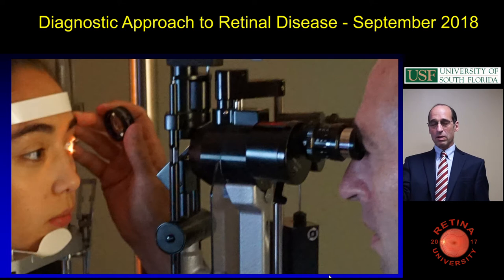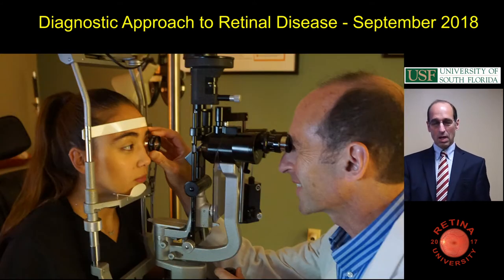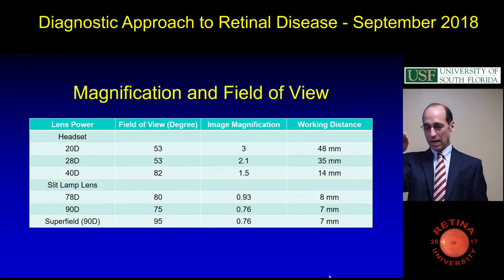So what I do is I have a whole routine. I put the slit lamp in, I line the light up with the eye, and then I flip the lens in. But it's all very quick now, because I've been doing it forever. And then I put the lens very close to their eye, and I back up a little. And usually that gives them the image. You back the slit lamp all the way up before you flip your lens in. And you can see the eye in the distance.